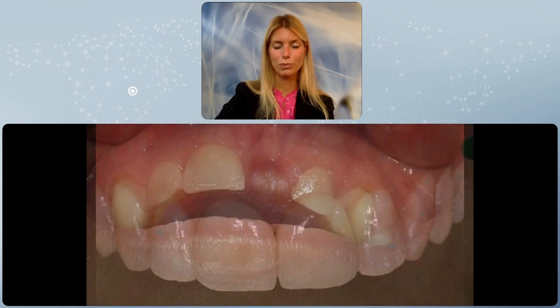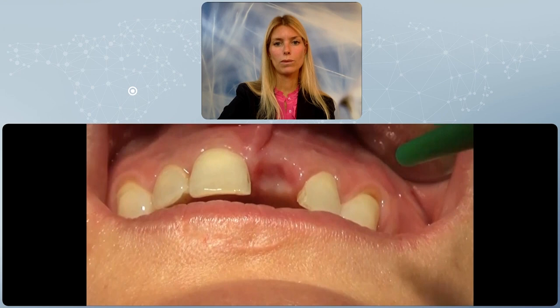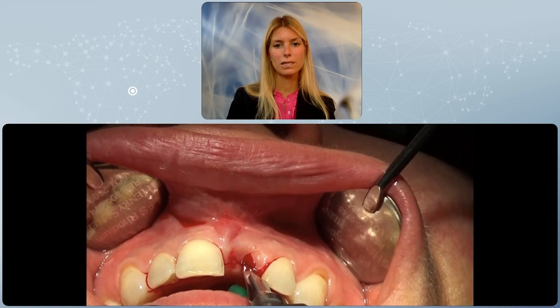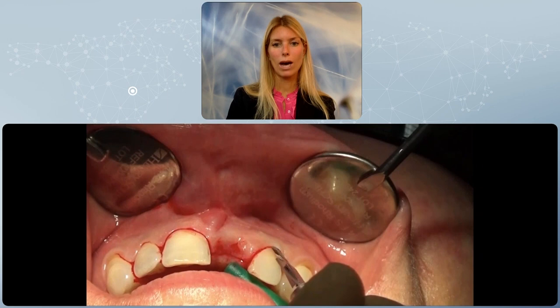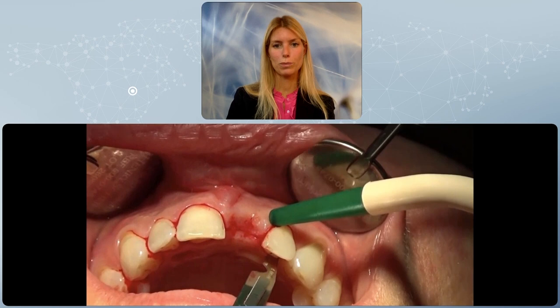So I will show you now a video of another patient with a very similar situation, and I would like to talk you through this video so that it will give you exactly the tips and tricks about it. So a mid-crest or full thickness incision is performed in a very slow way and in a very controlled way to allow a 90 degree incision between the papilla and the intrasulcular incision. This is very important to have a complete closure when we have finished our augmentation procedure.